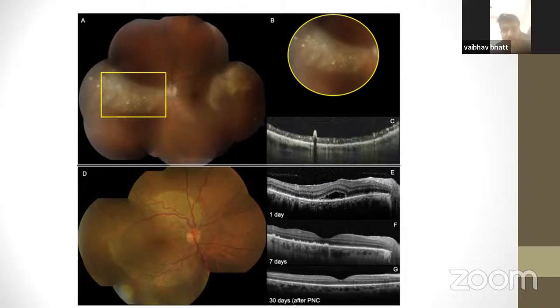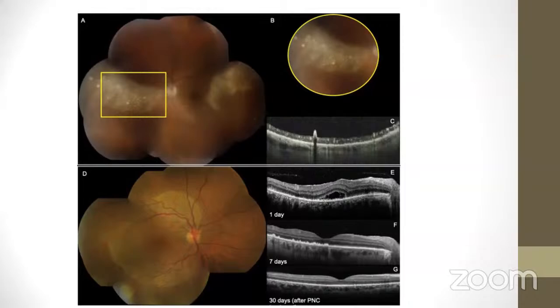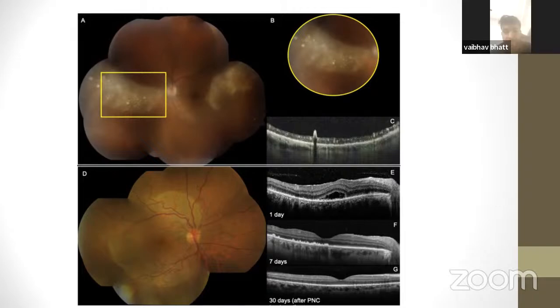The toxoplasma would have a hyperreflectivity in the retina with a thickened choroid. Right. So if you see that, you will come to it later, I think. Yes, sir. Just of these deposits, how will you differentiate?